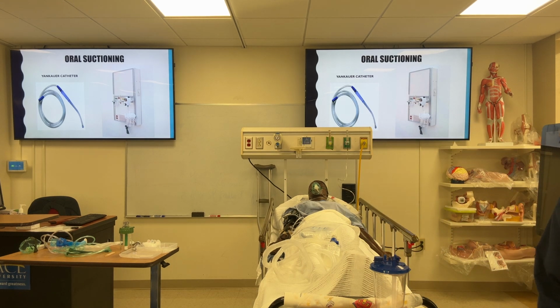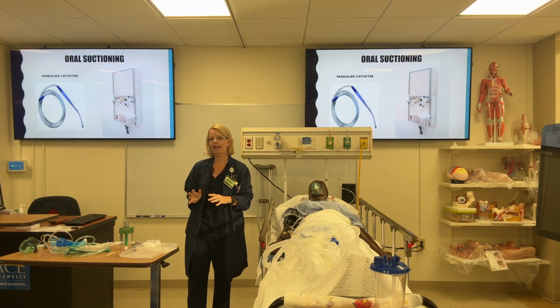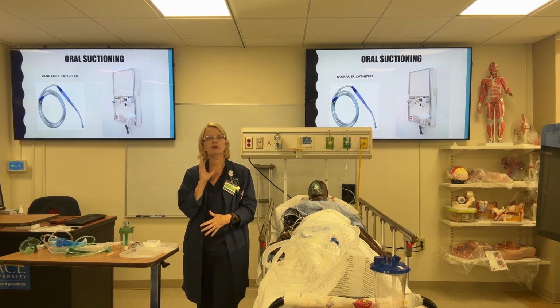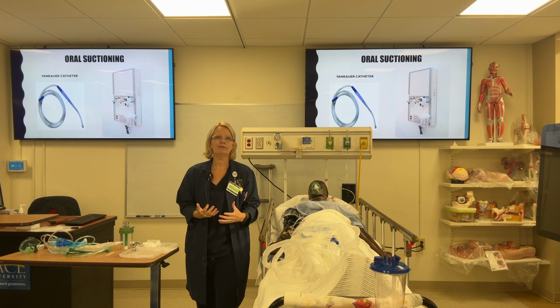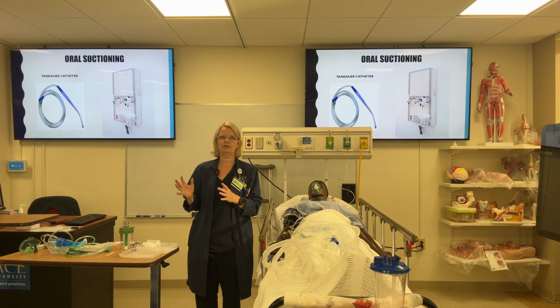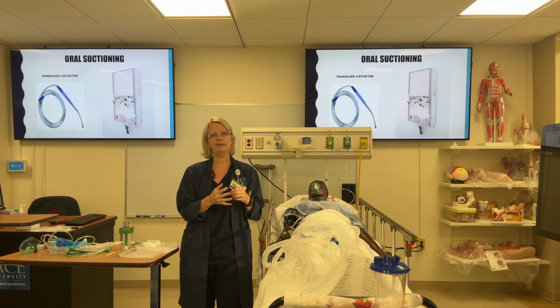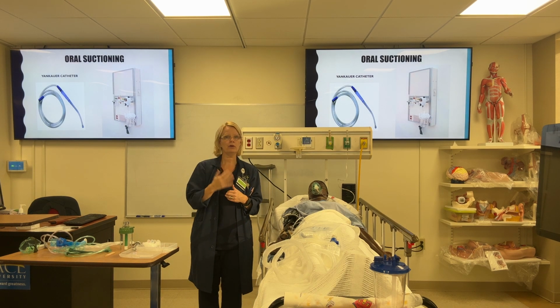The other thing I want to show you is suction, because suction goes hand in hand with airway and with oxygen, and sometimes patients are having trouble breathing, trouble controlling their airway. They're also having trouble controlling their secretions. So we do a lot of suctioning on patients in those situations, and there's lots of different ways to suction a patient. For you guys today, I'm just going to show you how to set up the suction machine and the tubing and the device and the canister, and then how to do simple oral suctioning.